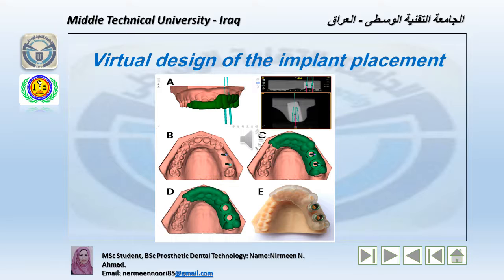The accurate fitting of the guide with the original plaster dental model is manually checked. A drilling sleeve is then inserted and glued in the template, which represents the actual guiding system for the surgeon's drilling operative step. Finally, a check is directly carried out in the patient's mouth in order to verify the proper fitting onto the dentoalveolar arch where soft tissues are present.